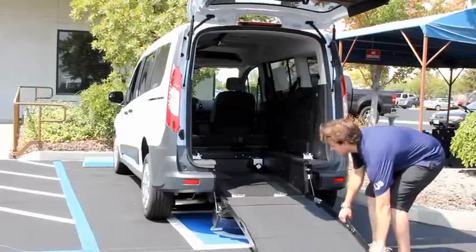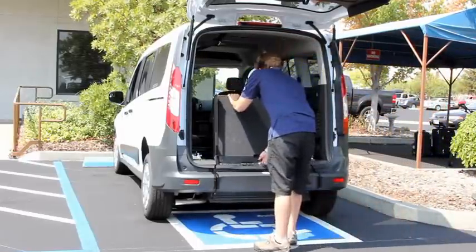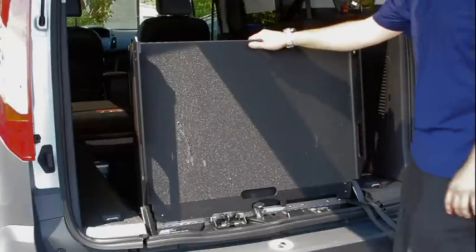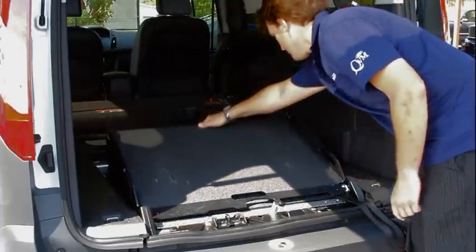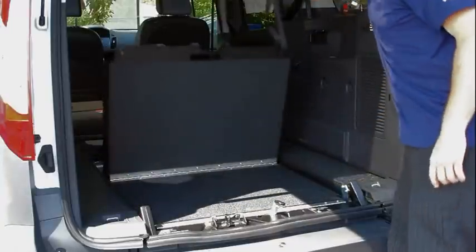Stow the ramp in the vertical position again. To stow the ramp flat, place your right hand on top of the ramp. Using your left hand, squeeze the lever and slide the latch to the right. Slowly lower the ramp into the vehicle, then use the strap to fold the ramp all the way flat.